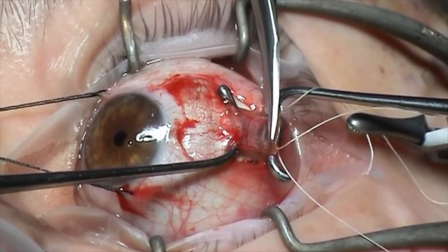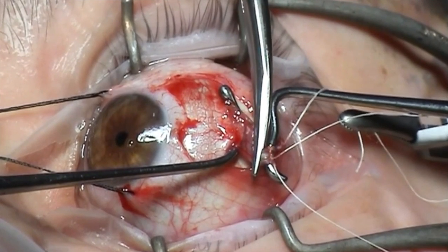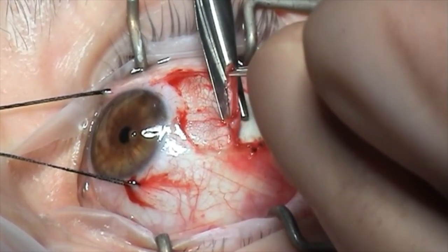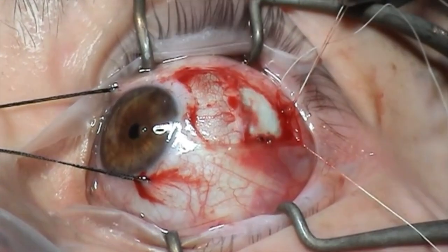A little bit of gentle cautery is performed and Westcott scissors are used to disinsert the muscle, making sure to cut the muscle a millimetre or so anterior to the sutures. Lifting up the remnant of the muscle, trimming it flush with the sclera and applying some gentle cautery.